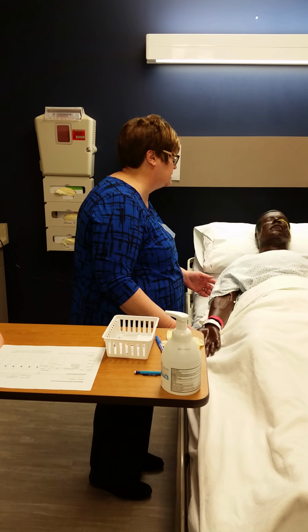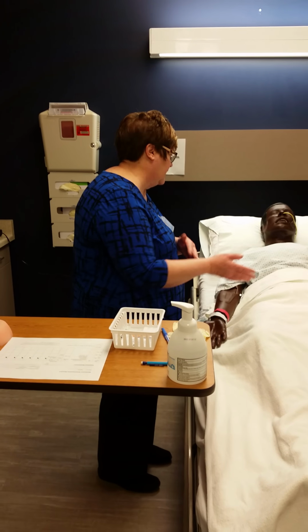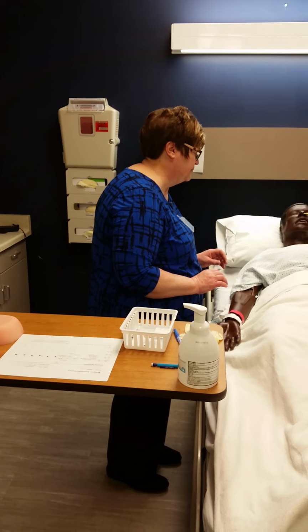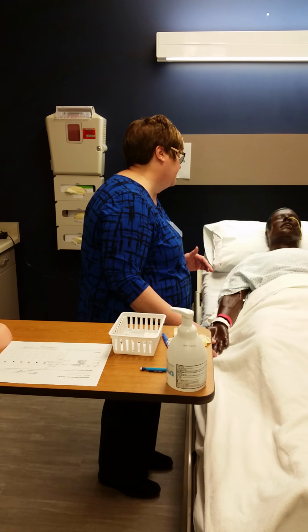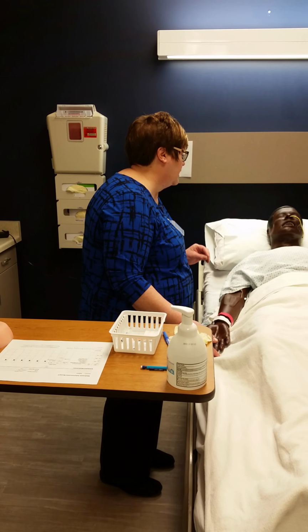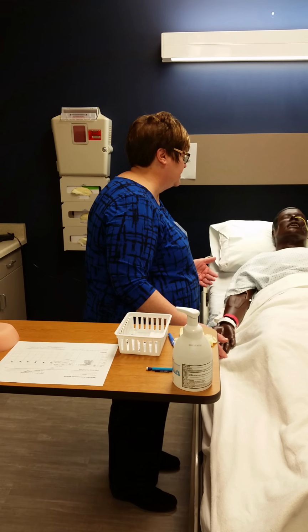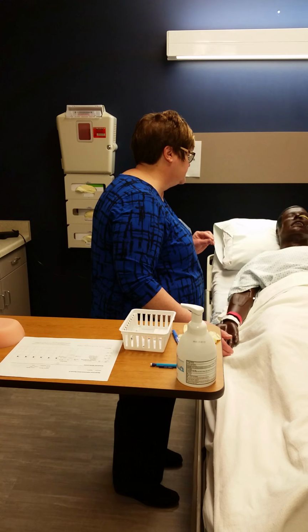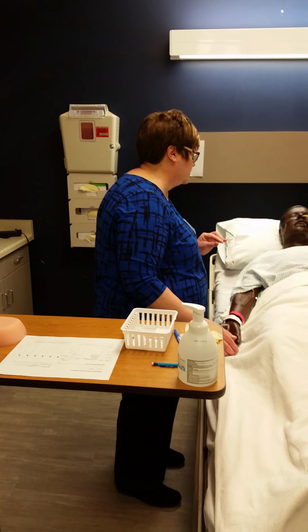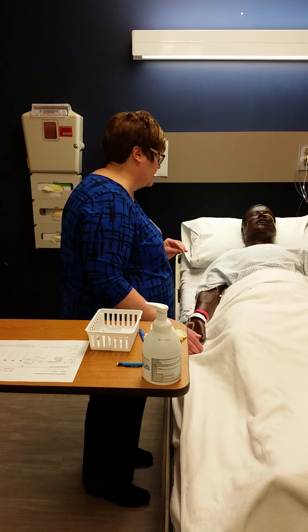Okay, Casey, today your doctor has ordered for us to give you a tuberculin skin test to detect if you've been exposed to tuberculosis. The skin test will be on your forearm, and what I'll be doing initially is evaluating the forearm to find a good spot where the skin does not have any scales or tattoos, any scarring there at all. If there's any veining there, so we're looking for pristine skin. So I'll be palpating on those areas to find that. Later, I'm then going to be inserting a needle underneath your skin and give you a very small amount of fluid. This should not hurt at all. It's going to form a little wheal or look like a mosquito bite when I'm done. I ask that you not rub it or scratch it at all.